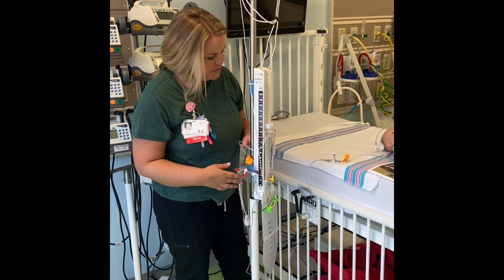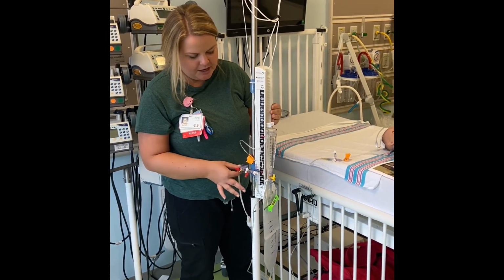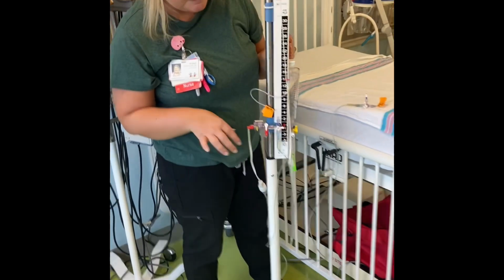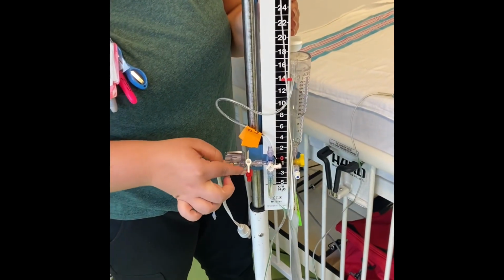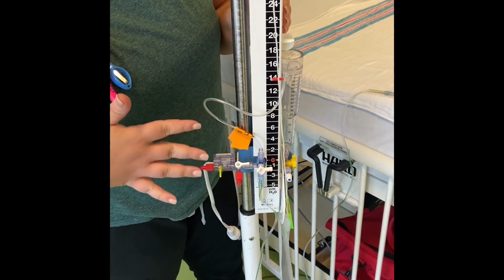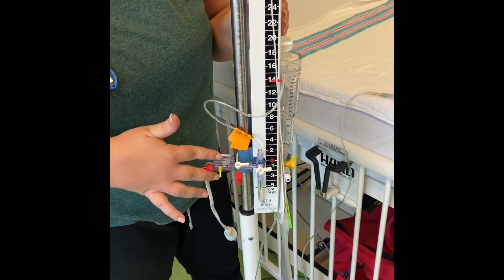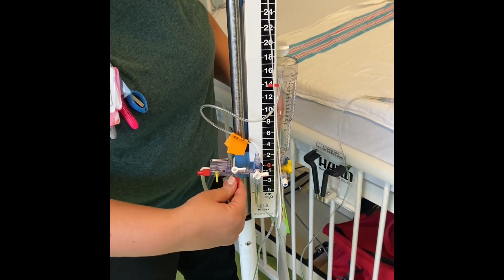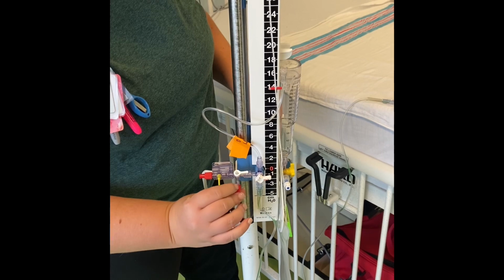So what we need to do first is come to the stopcock that's attached to your transducer. We are going to turn this stopcock off to the rest of the EVD drain, because at this point we only want the transducer in contact with your monitor. Once you do that, you're going to take your red cap off.